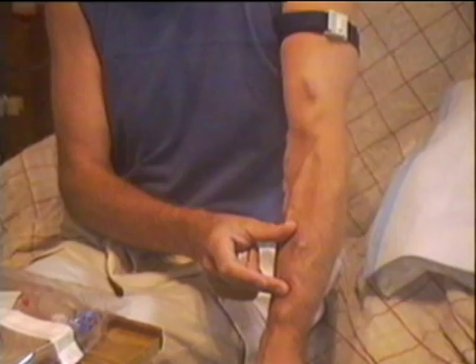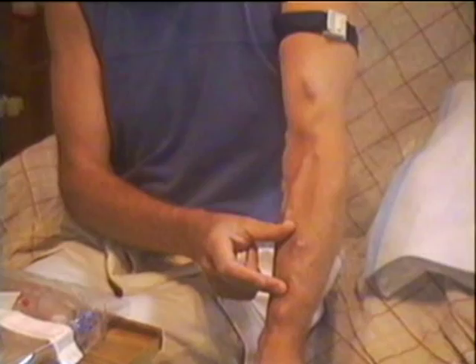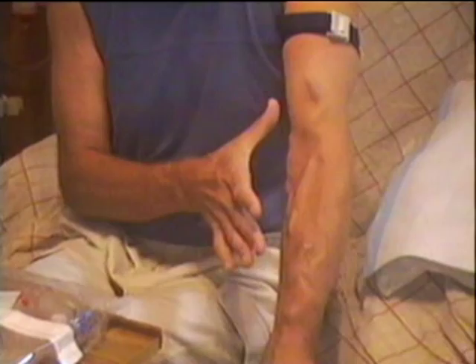I use two points: down here for the blood to come out, and up here for the blood to go back in. That gives a good distance apart. A lot of people use both out and in down at the bottom, but I feel the blood going back in could be redrawn back through the machine. I feel you get a better amount of blood with the two points at a good distance apart, so more blood goes through the machine and you get better cleaning.